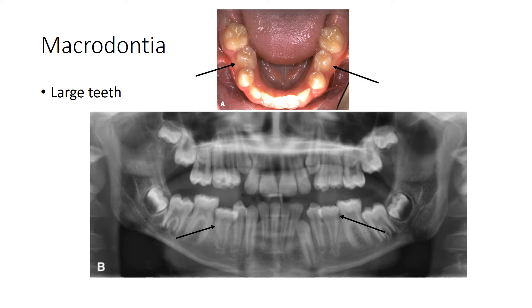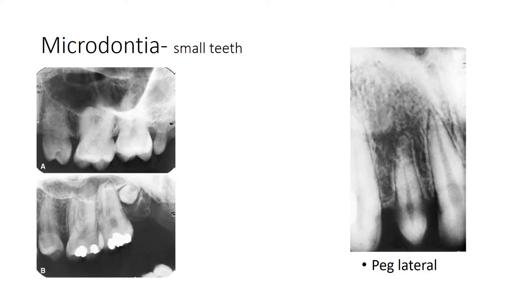Macrodontia is a condition where there is a larger size of the tooth. Here we are pointing out a molar and a premolar — the premolar looks really wide and larger than the adjacent premolar, and this is macrodontia of the premolar bilaterally. Microdontia, on the other hand, is a terminology used for a smaller tooth. The examples in A and B are microdont third molars, one erupted and one still impacted. Peg lateral is another common example of microdontia where the lateral incisor is more conical or peg-shaped and smaller in size.